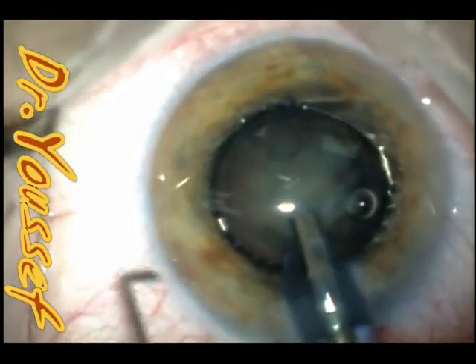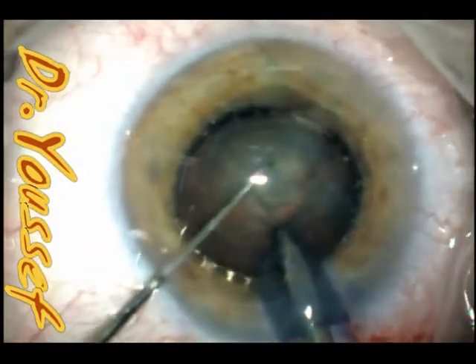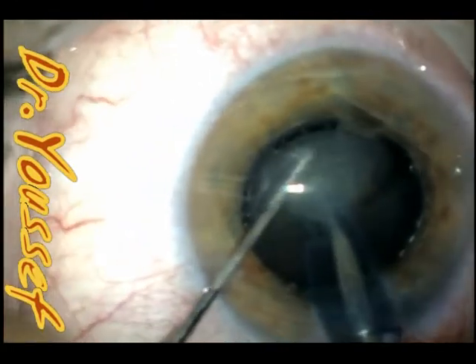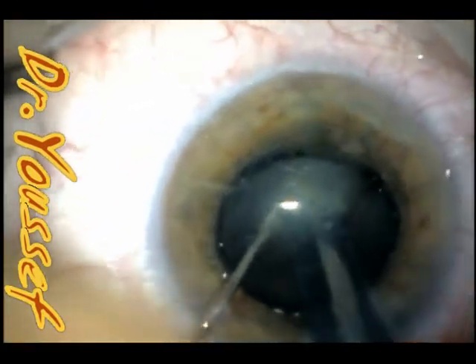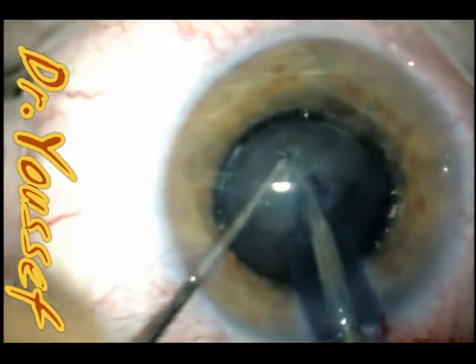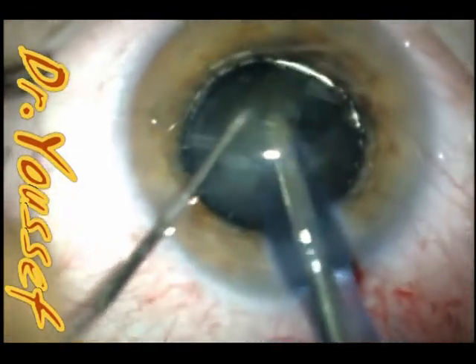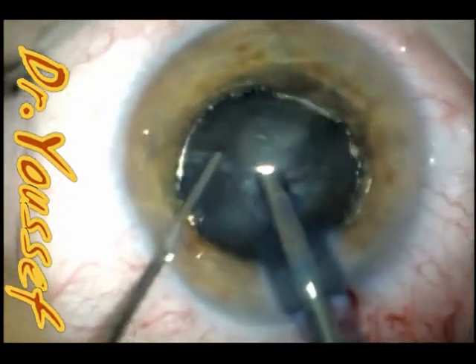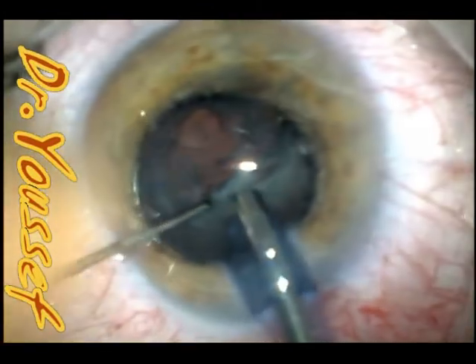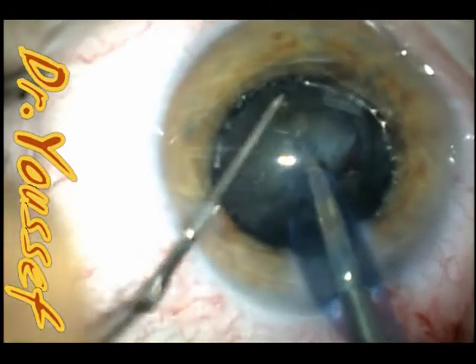I use the chopping technique to remove the nucleus. When you introduce the chopper through the second wound in cases of shallow chambers, it can sometimes be difficult to pass across the pupil with the Malyugin ring in place, so just be careful — it can dislodge the ring and add time to the surgery. As long as you have a nicely dilated pupil and stability, the rest of the surgery is almost like a normal case.